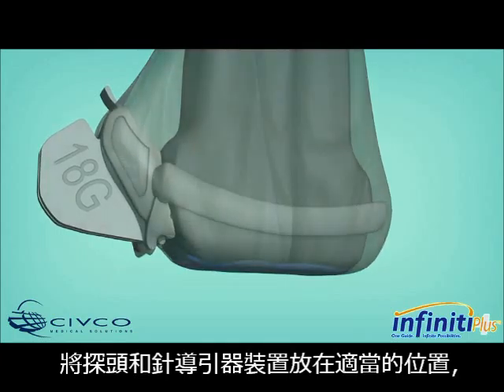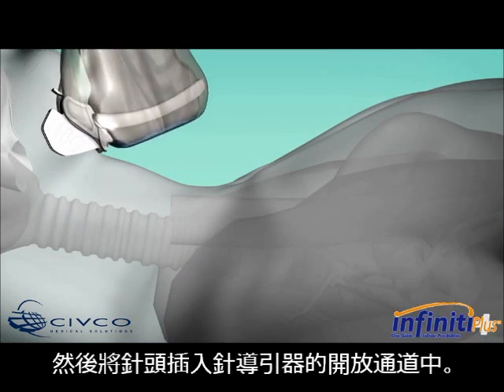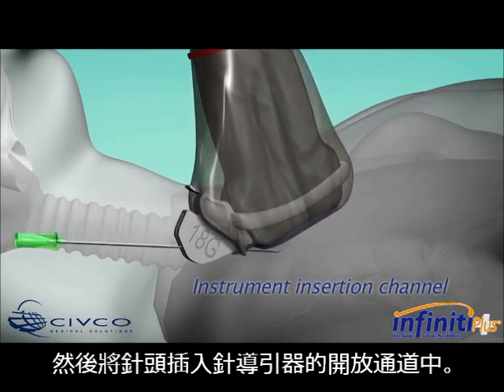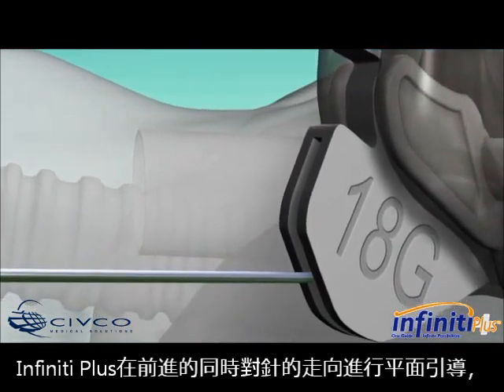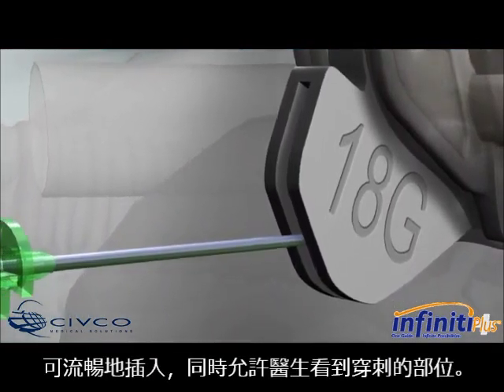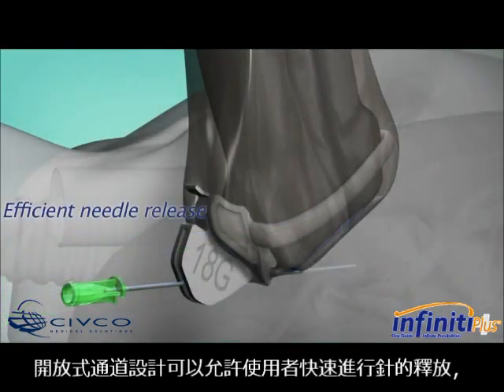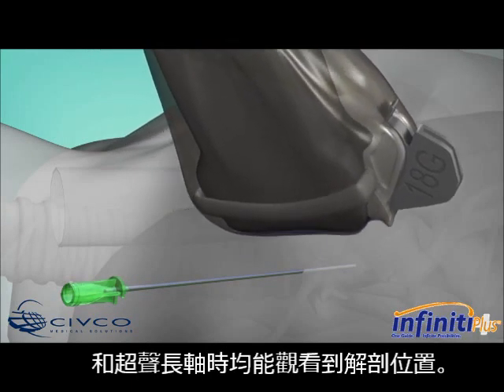Place the transducer and needle guide assembly in the proper location to reach the targeted anatomy. Then insert the needle into the open channel of the needle guide. Infinity Plus guides the needle in plane as it is advanced, providing smooth insertion while allowing you to see what you puncture.